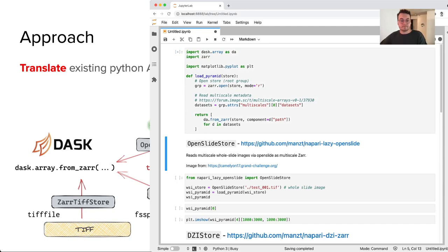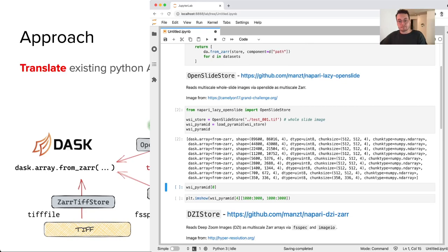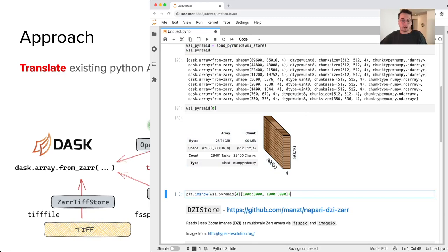I can use the open slide store to open an image that is compatible with the open slide library and load each resolution as a separate Dask array. I can inspect the highest resolution by printing out the first element in that list, and I can also draw a particular region at a different resolution by using NumPy indexing.